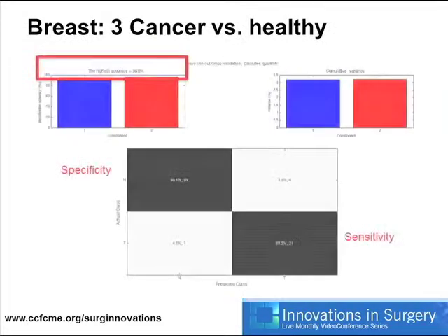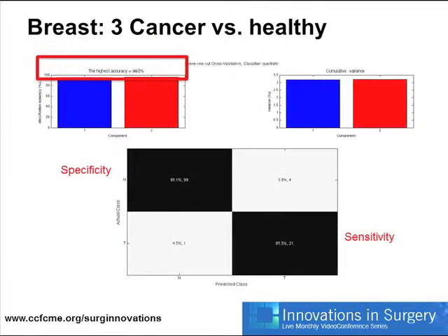And each dot there, of course, represents a single spectrum at a point in time. So that's probably several hundred or 1,000 or so metabolites that we're measuring at that one point. What we get when we look at the data is we put a lot of emphasis on cross-validation and ensuring the robustness of our data sets, because if this is going to work in a patient, we really have to be sure of its diagnostic accuracy.